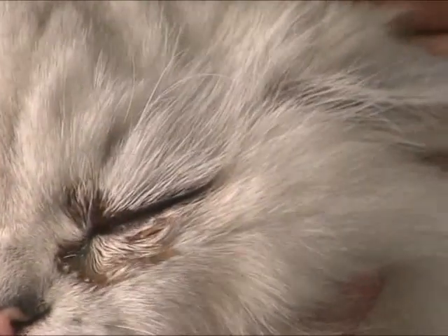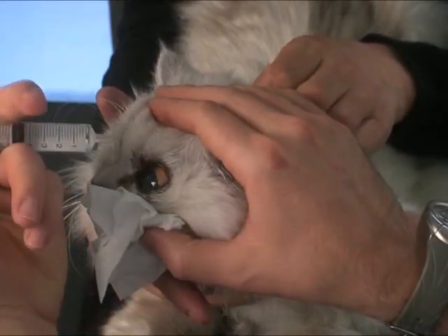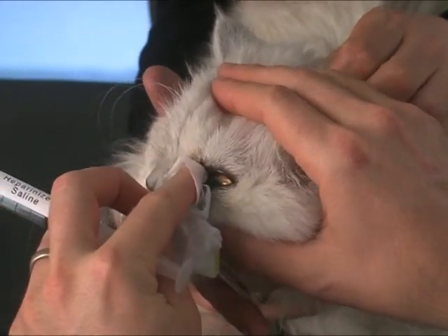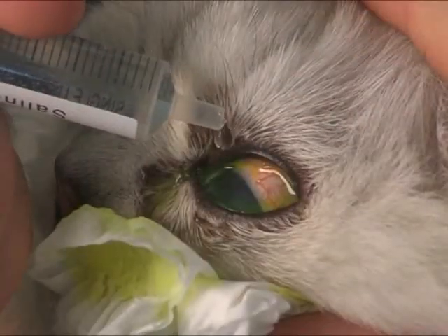After application, the eyes should be irrigated with sterile saline to remove excess fluorescein. This helps to prevent false positives and does not interfere with fluorescein uptake when an ulcer is present.